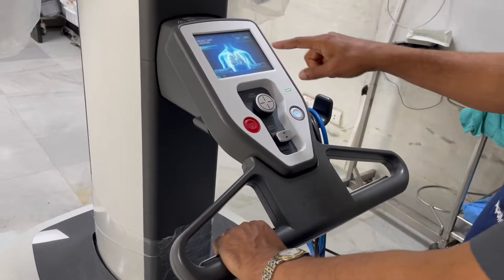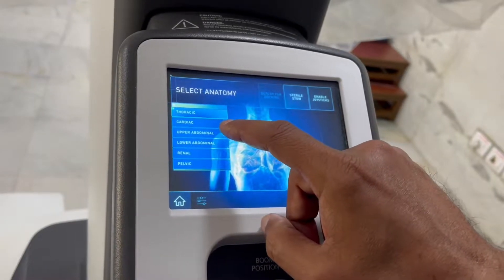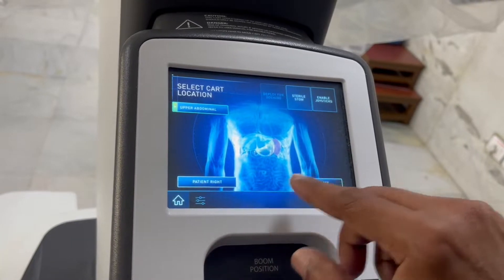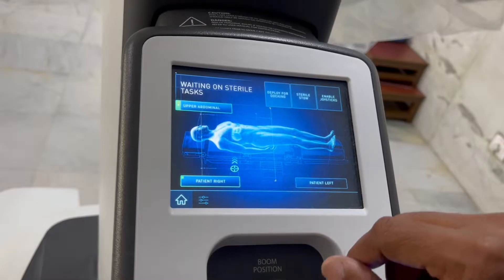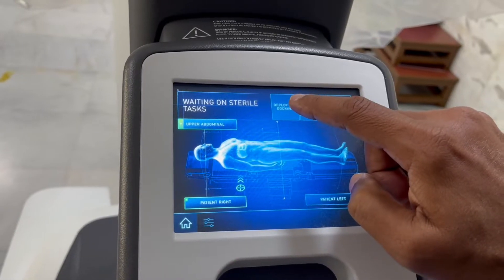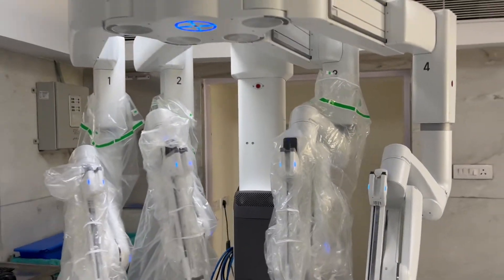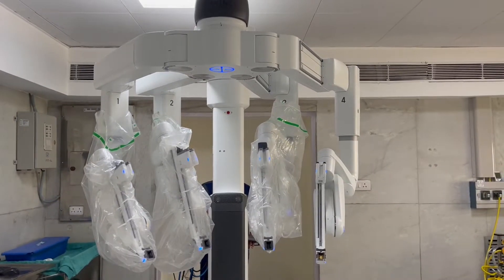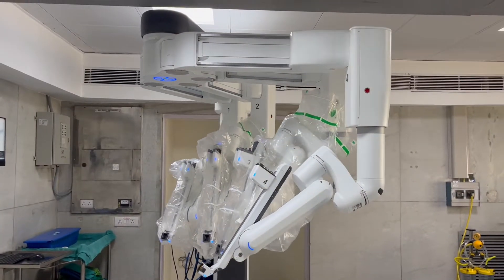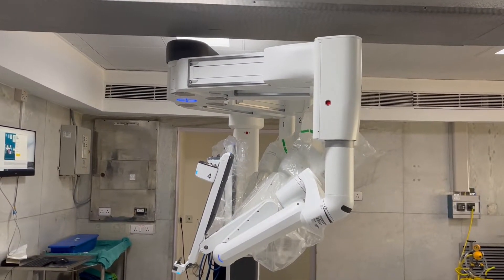Then we have further controls here. If I go to home and select, I am going to select upper abdominal surgery, which is what I use for bariatric. Now it gives me the option of patient right or left. Let us go to patient's right and now I am going to start the docking process. The robot is moving forward and because we have to deploy from the right, it is turning on its own. Now this is a lateral docking and the robot and instruments are ready.